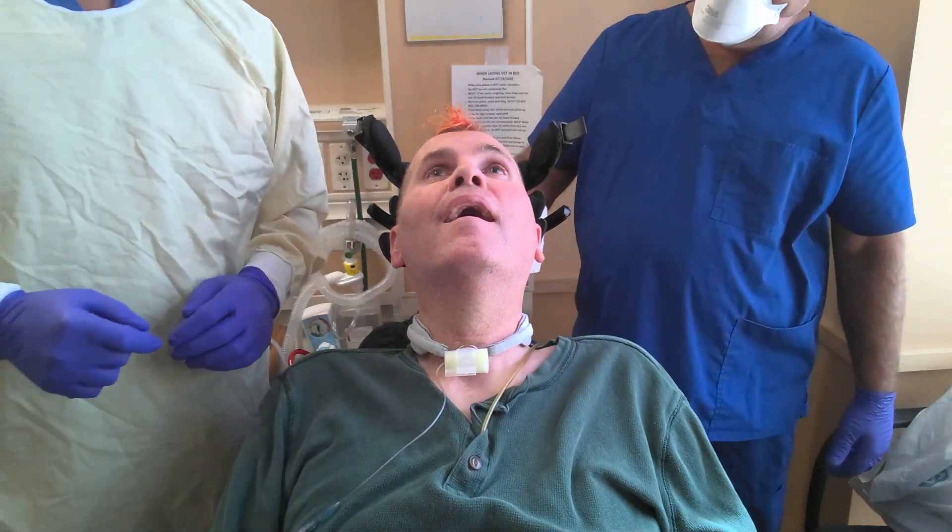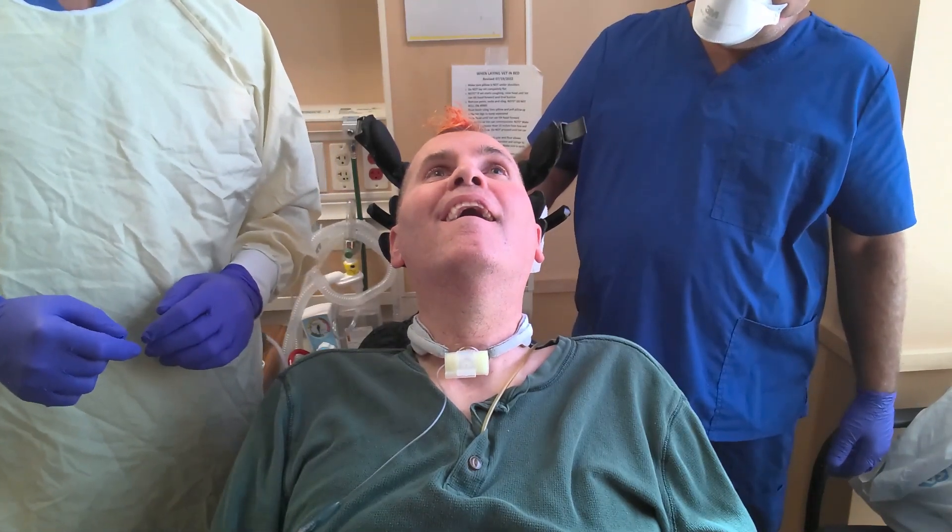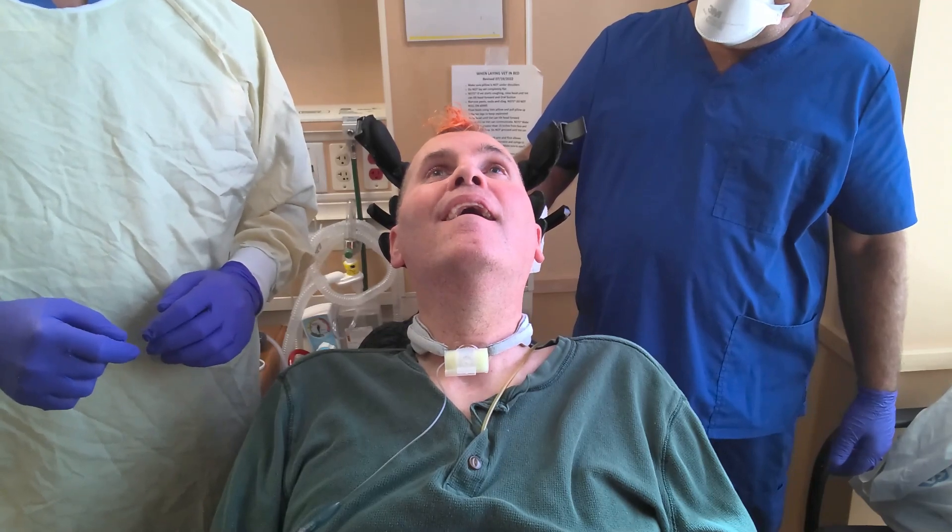Are you okay with your head like that? I'm going to loosen this. Get comfortable. You guys want to leave that better?